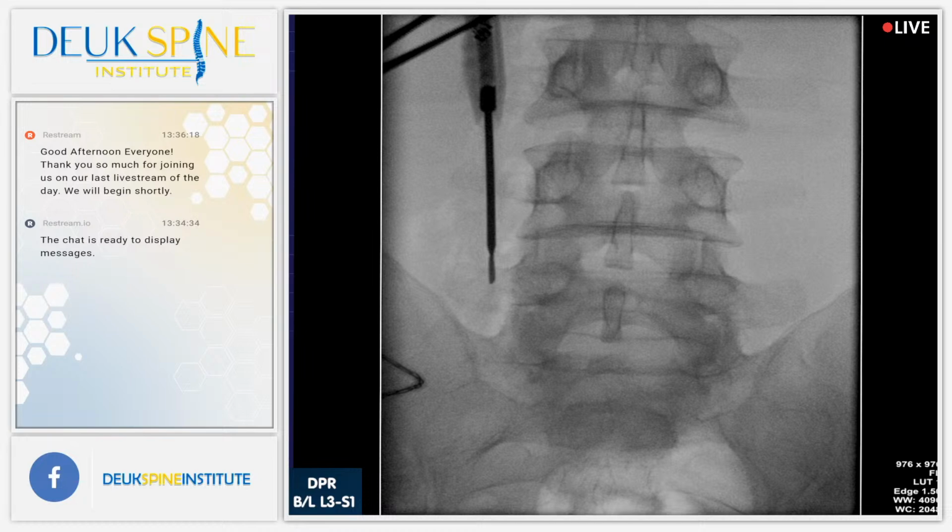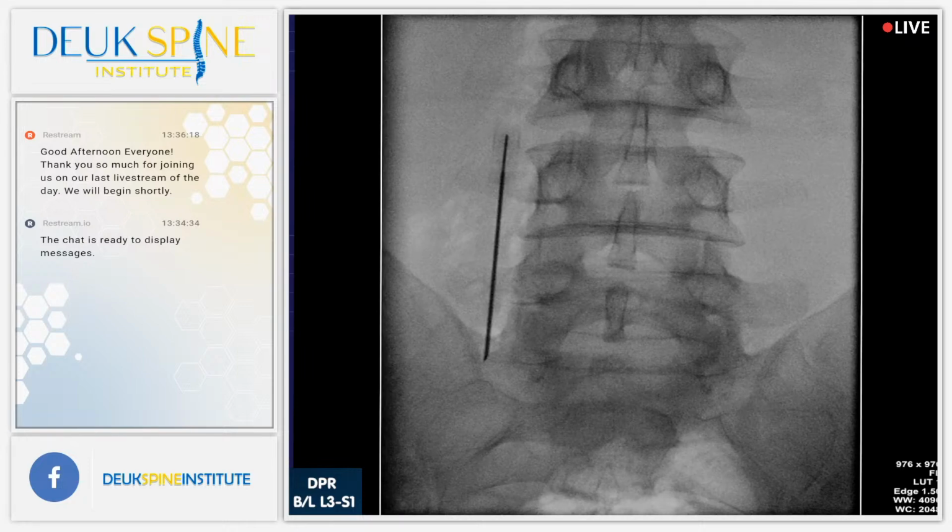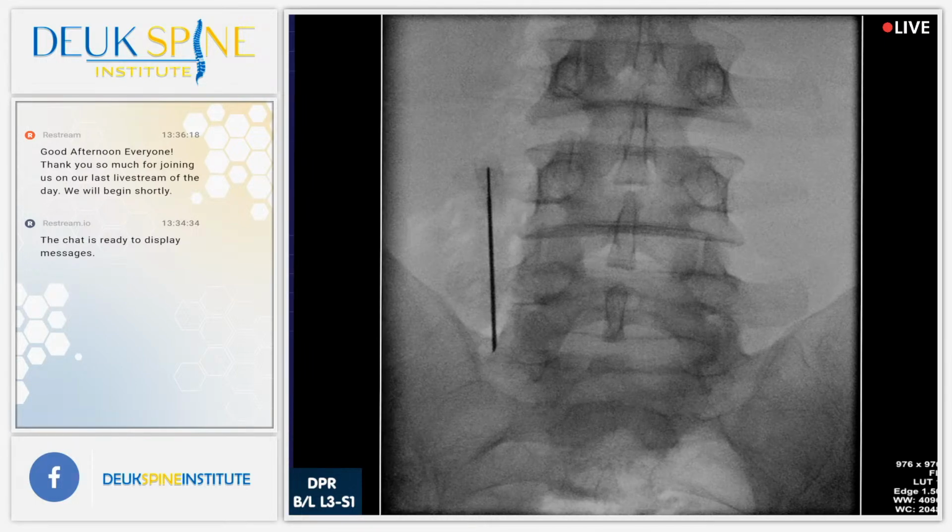The nerve is not the same as the nerve root. Many people think we're actually damaging the nerve root, but we're not. You never want to damage a nerve root. Nerve roots are special, important. They control motor and sensory function in your legs, arms. We never want to injure a nerve root. We always want to just get rid of nerves that actually are just pain nerves. And that's what we're doing here with this procedure.